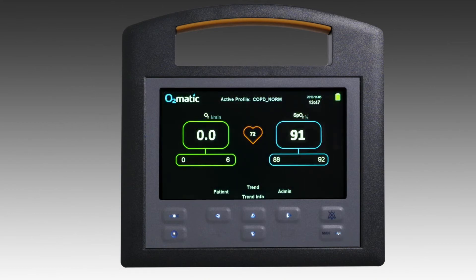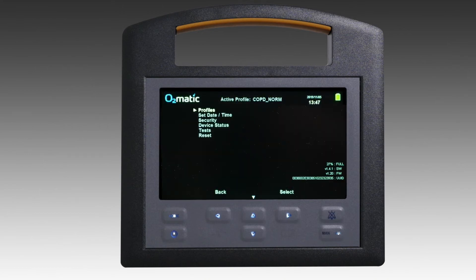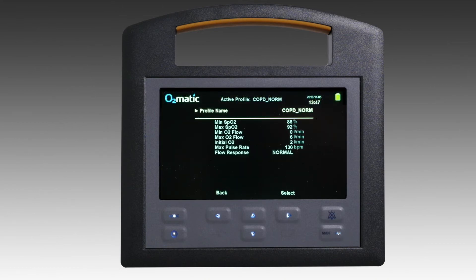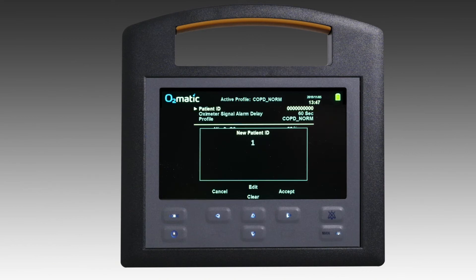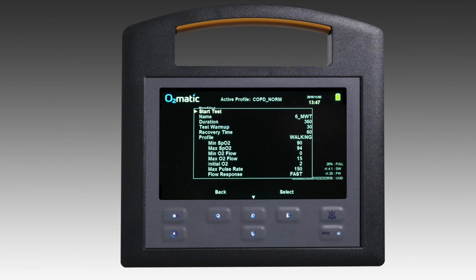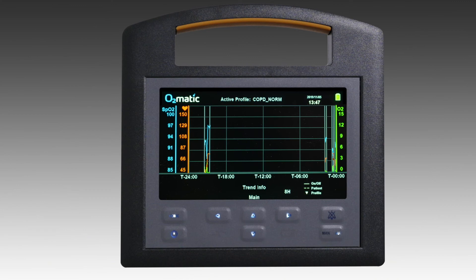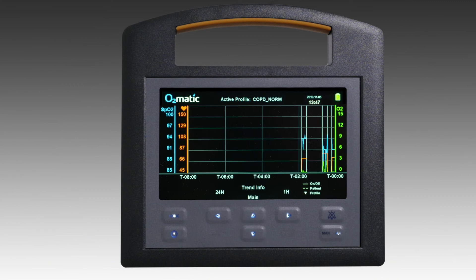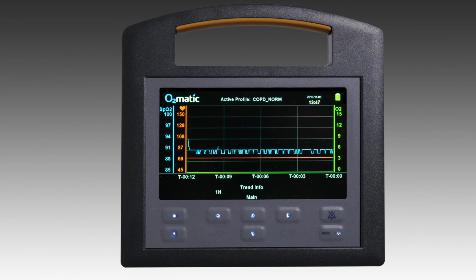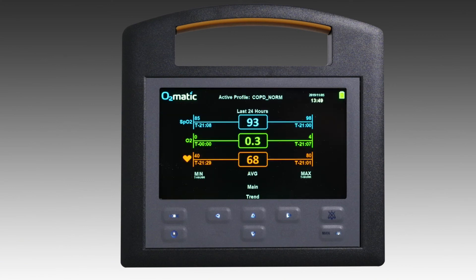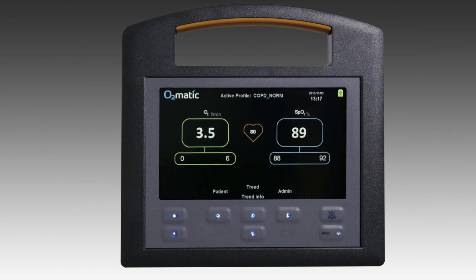Several menu options are available on the O2Matic via the menu screens, including patient profiles, walk tests and detailed 24, 8, 1 hour as well as 12 minute trend screens. The O2Matic will continue to deliver oxygen therapy whilst the menus are being accessed.